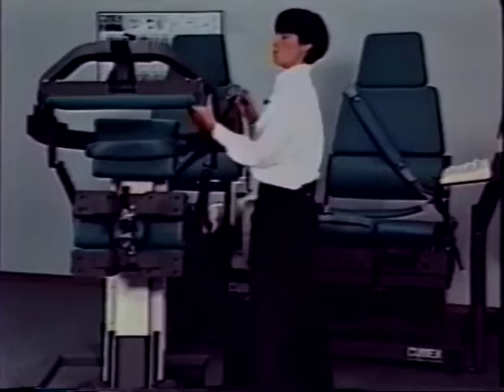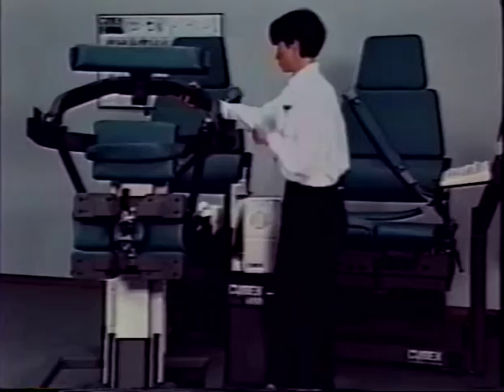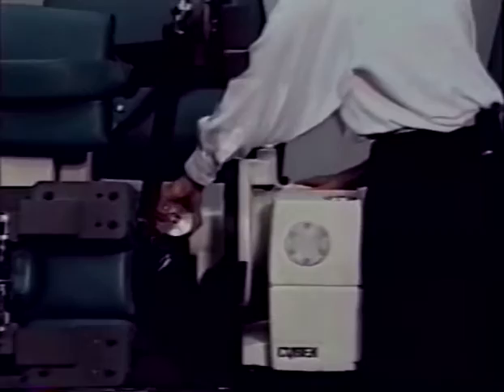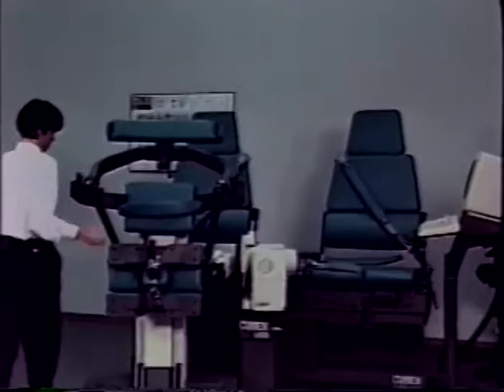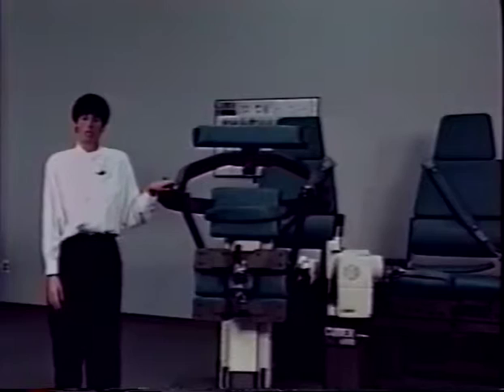Move the input arm back into the extension position and secure the knob on the dyno docking adapter. To fully secure the TEF modular component, lock all three caster wheels. The docking of the TEF modular component is now complete and you are ready for patient setup.